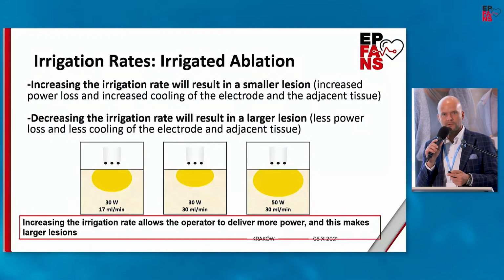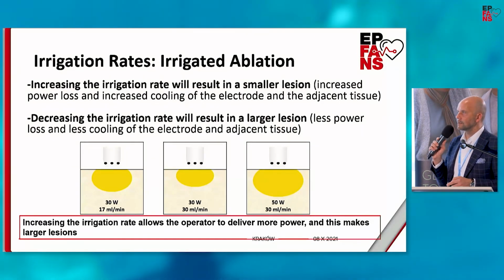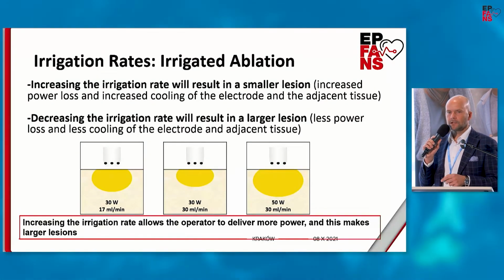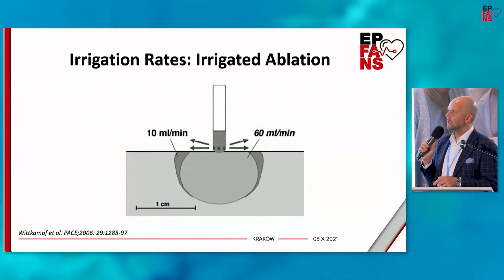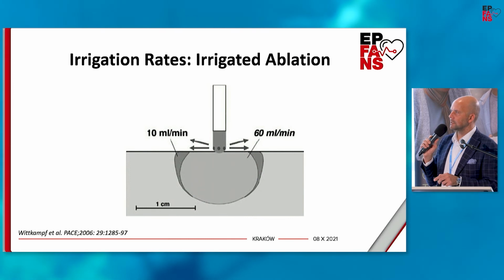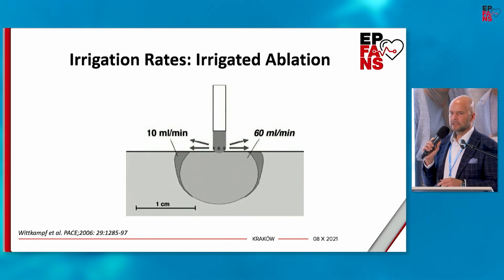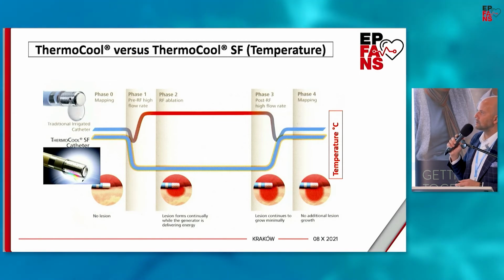On the other side, when irrigation flow is increased above the recommended value, the superficial diameter of the ablation lesion is reduced. It is because with increased irrigation, some part of the energy is eliminated in superficial regions, and that may lead to creation of edema and a temporarily continuous ablation line, which within the next hours or days results in a reconnection between isolated regions.